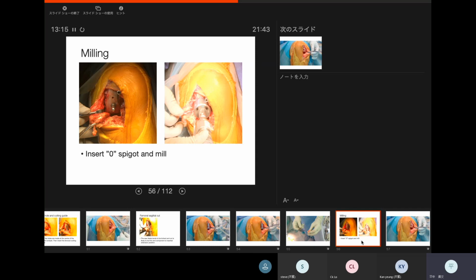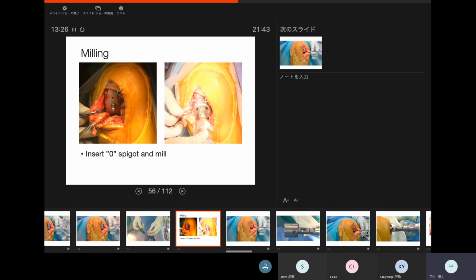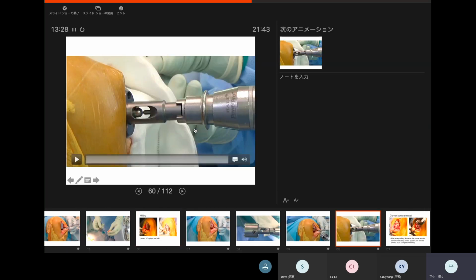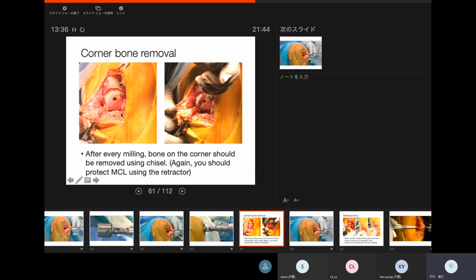After the posterior condyle cut, you should do the first mill, using the zero spigot until this bar is touched in the window. Then remove the corner bone using the chisel as here.